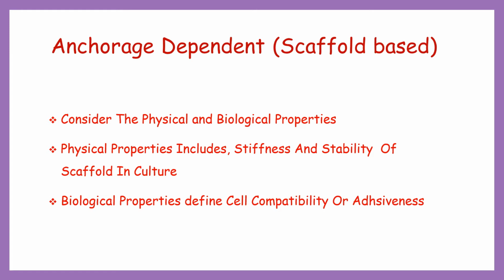Hard polymers can provide the physical support found in specialized tissues such as skin, tendons, or bone, and micro-patterned surface microplates can be designed for specific applications such as support of cell networking.